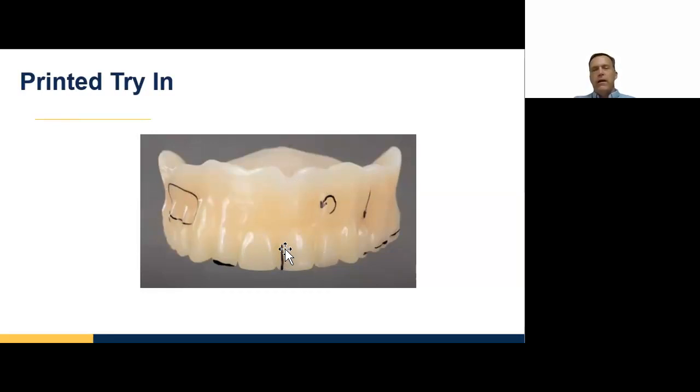You can mark on it. You could score a new midline. You could shorten things. You can mark on it with a Sharpie. You can take the case home for a test drive. So again, talk with your laboratory about the digital workflows that are available. But if you want to do digital work dentures, this can be a good advantage for you.